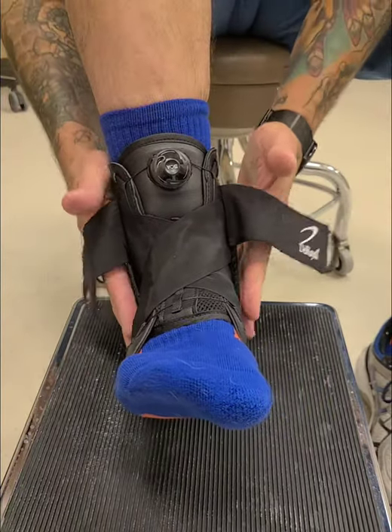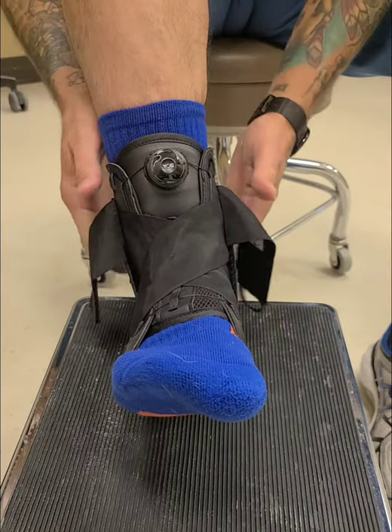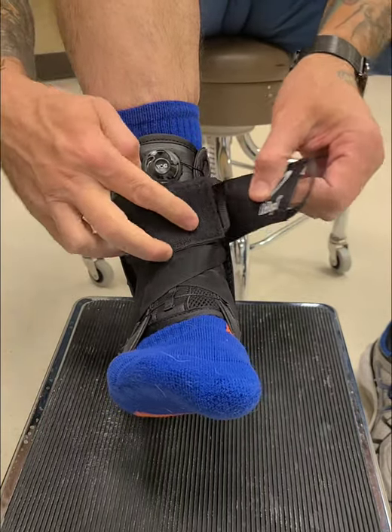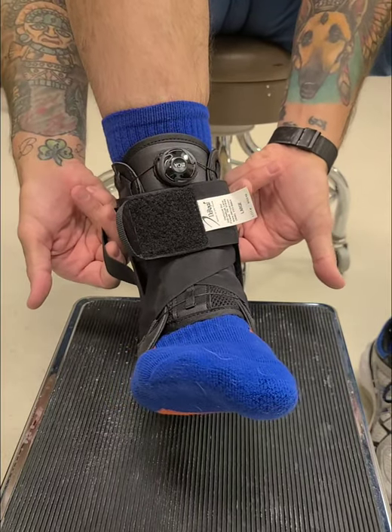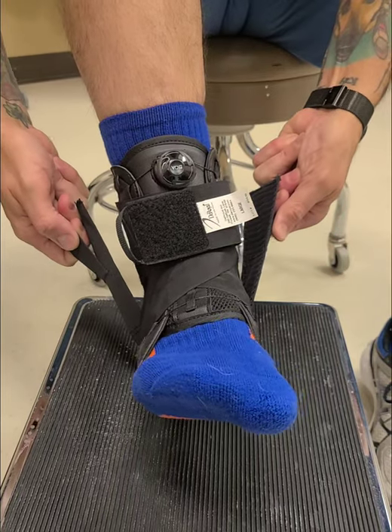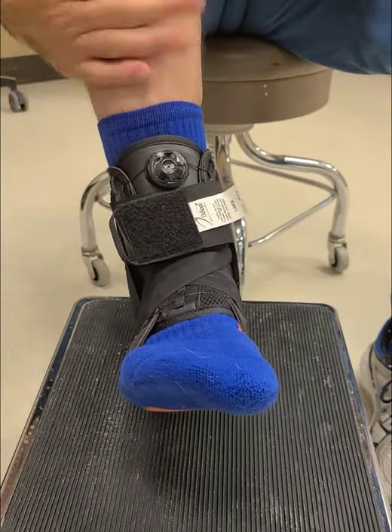Now, as I tell you in my other video, we just pull flush — we don't pull hard — because we're going to tighten them at the same time together. At this point move them to the front, grab both straps with at least two fingers each, undo them both, and pull up nice and strong and equally, then lay them down while pulling. That gives you your true support.